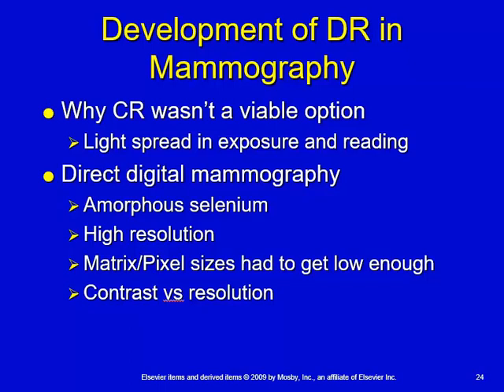When a cancer is detected or suspected, we do mammography. What they're looking for is what they call microcalcifications. And just like the term suggests, there are little bitty tiny pieces of calcium inside of the breast tissue. Now, breast tissue being inherently low contrast tissue, it makes it very difficult if any degree of ambiguity exists in the light signal that's coming off of those phosphors.